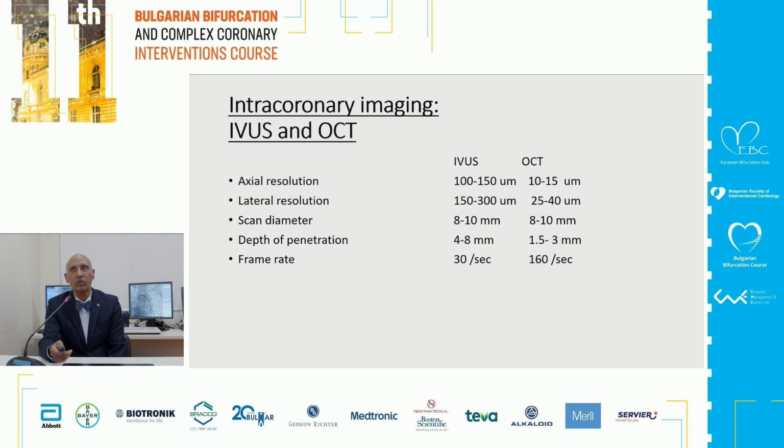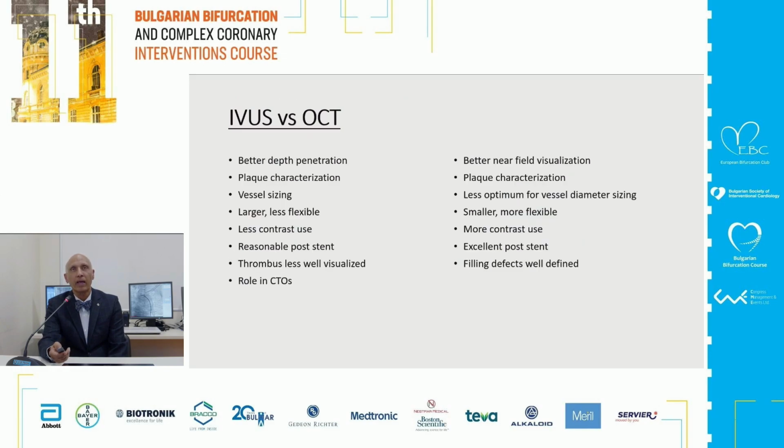I will not go through this. But the different properties of the IVUS and OCT are what dictate the appearance that you just saw. And these are some of the pros and cons of IVUS versus OCT. Again, I don't really have to go through that. In my experience, either one is good to detect calcification, the extent of calcification, the depth of calcification.